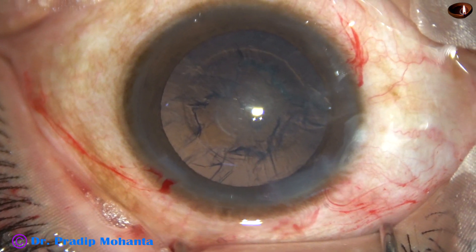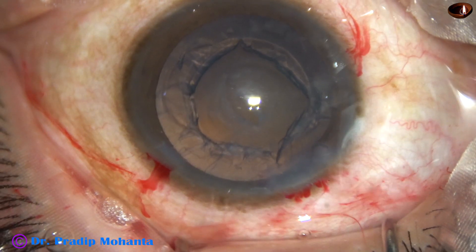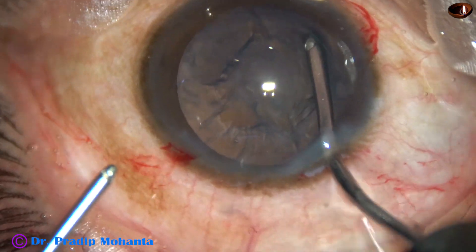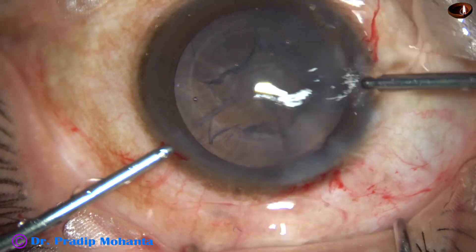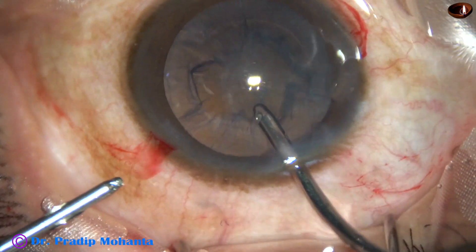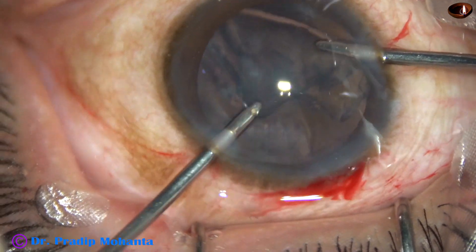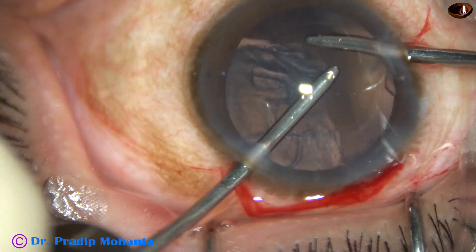Now some visco is applied. In this case, I have asked for bi-manual irrigation aspiration. I use the irrigation to hydrate the lens matter all around, and then I go through the side ports after hydrating all around. Now I start aspirating the lens matter. This bi-manual irrigation aspiration set is from Oatly — beautiful design.